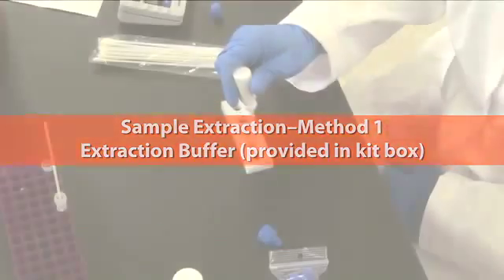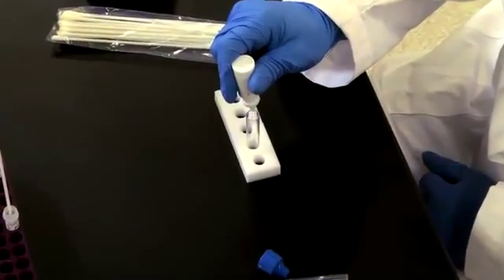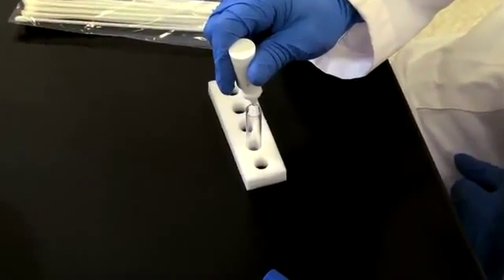Sample extractions may be performed using either of 2 methods. If you use the extraction buffer method, the extraction buffer is provided for you in the FluDETECT AIV test kit. First, place 8 drops, approximately 250 microliters of extraction buffer in the test tube provided.